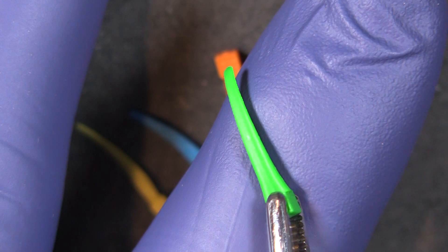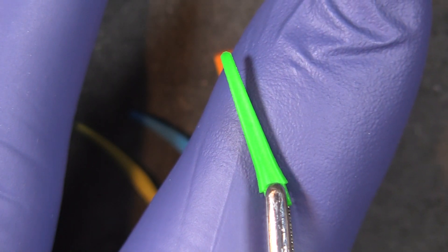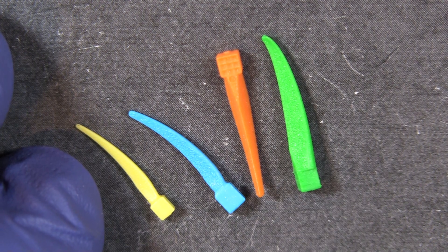The ski-like tip and those nice soft edges all the way around the bottom help prevent trauma and bleeding. G Wedge from Garrison Dental Solutions.